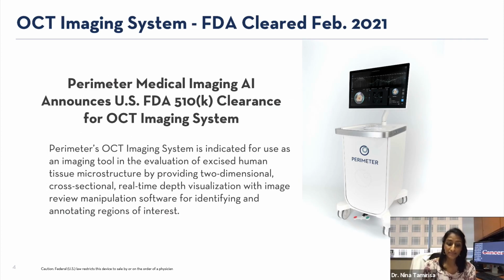So the OCT imaging device that was used during the data collection that will be presented in the case reviews today is FDA cleared under a general tissue indication, and this allows for the device to be used on any excised tissue, including breast tissue.